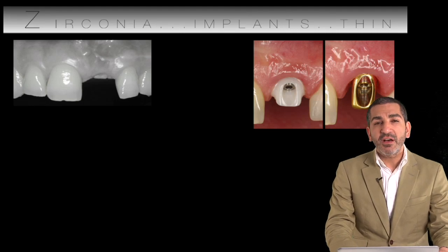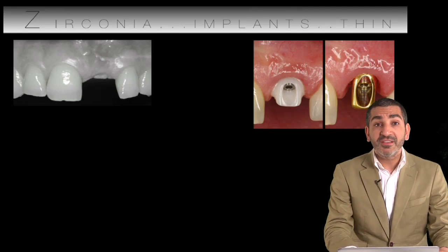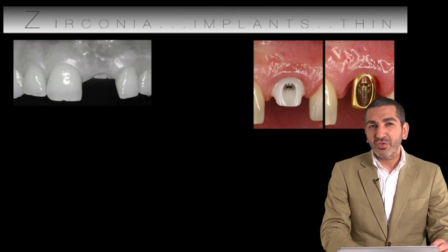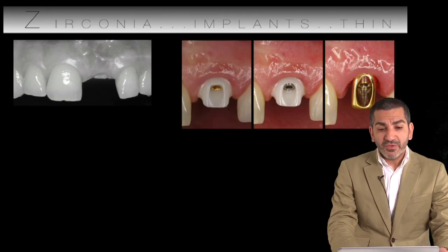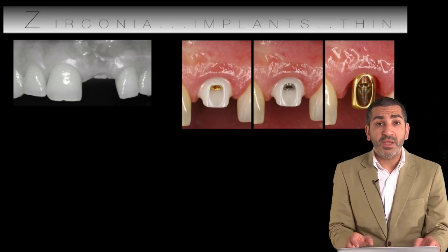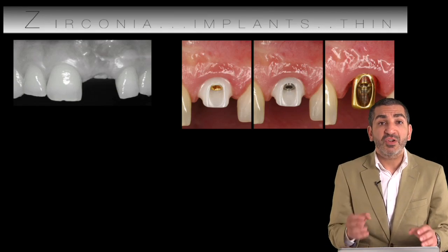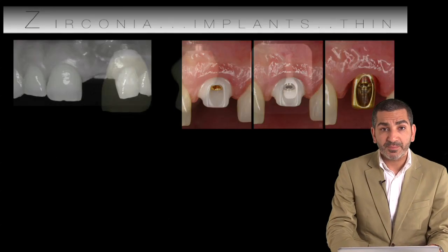But interestingly enough, we could even see the gold screw, or in this instance, the silver screw has an influence on the soft tissue color. It gives it that gray color and that sort of lower value effect on the soft tissues will have an influence on the definitive restoration as well. So the color of the screw has an influence. There's a difference between a gold screw and a titanium screw when we have a zirconium abutment with thin tissues. All of these factors will play an influence.